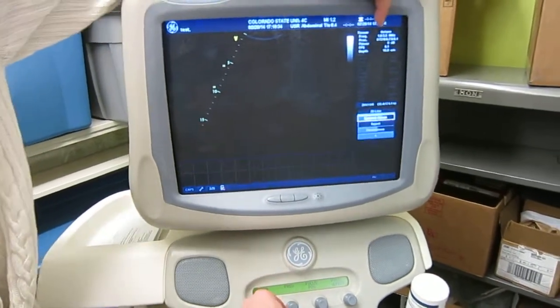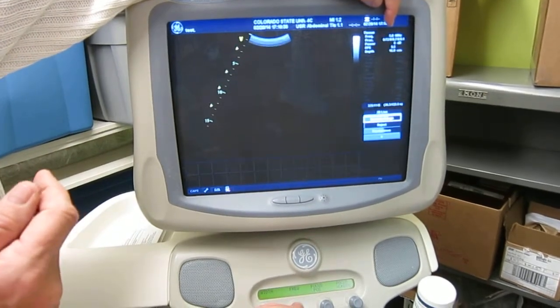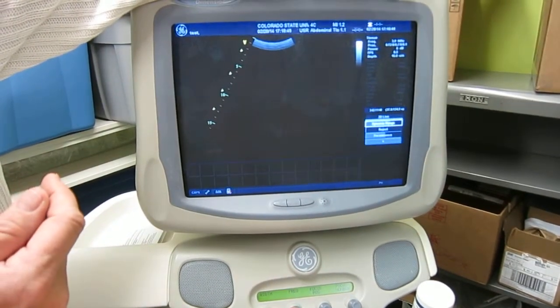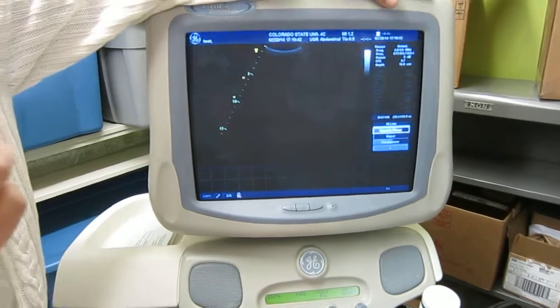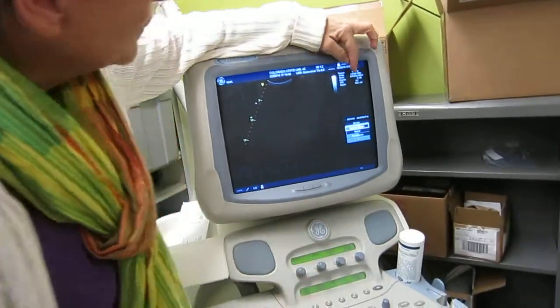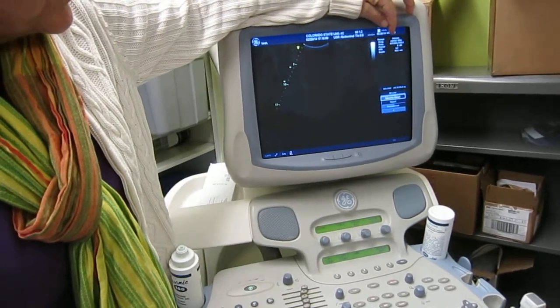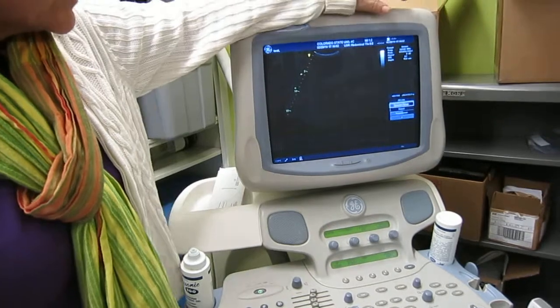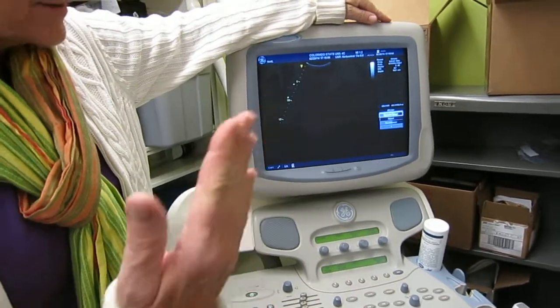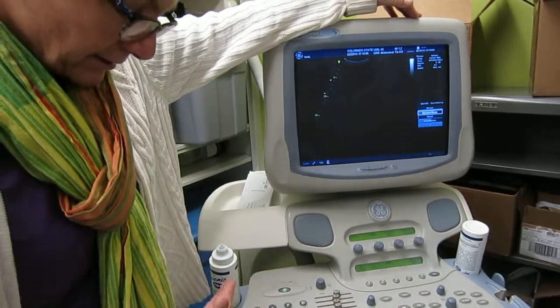And see when it hit this octave word, back off until that's gone. We'll go with the forward. The slow. So it goes to 3 on the imaging. So it was 3 to 5, just as we predicted. But once it goes and says octave, that's a harmonic imaging mode. And so usually harmonics, it actually receives the second harmonic of sound that comes back to your transducer instead of the first one.